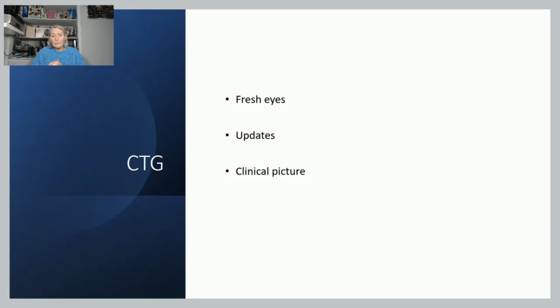From my point of view, if you were a senior midwife running delivery suite, it's also quite useful for you to know what's going on in different rooms. Not all trusts have central monitoring. So if the core midwife or midwife in charge isn't coming in to see your CTGs, very often she can be unaware of developing patterns.